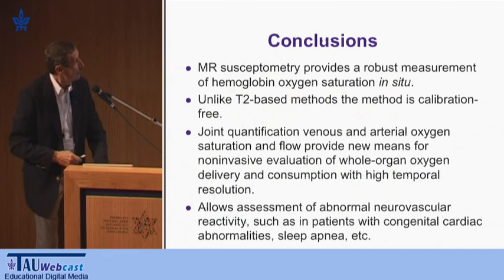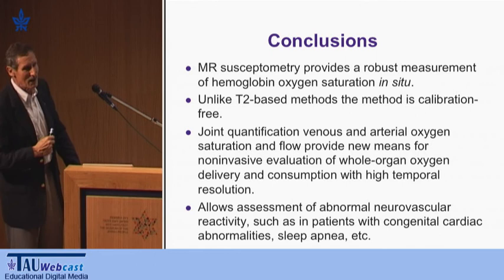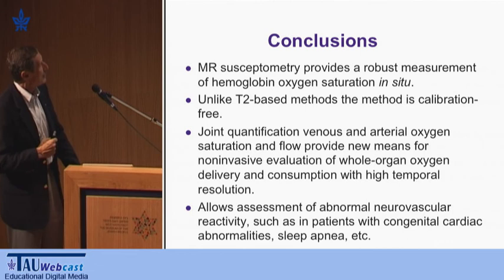So in conclusion, we call this technique MR susceptometry. It provides us with quite a robust means to quantify hemoglobin oxygen saturation in situ, in vivo, in human subjects.